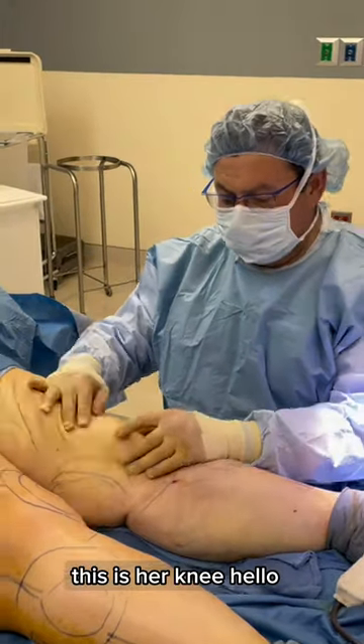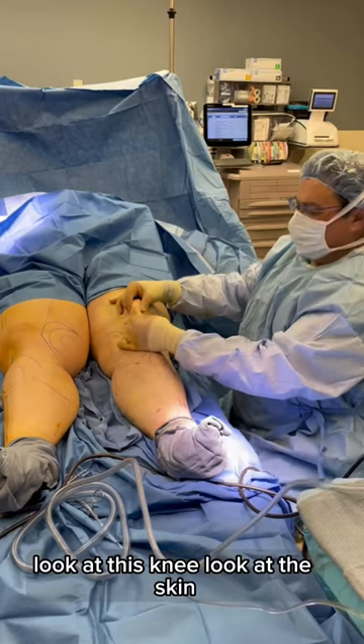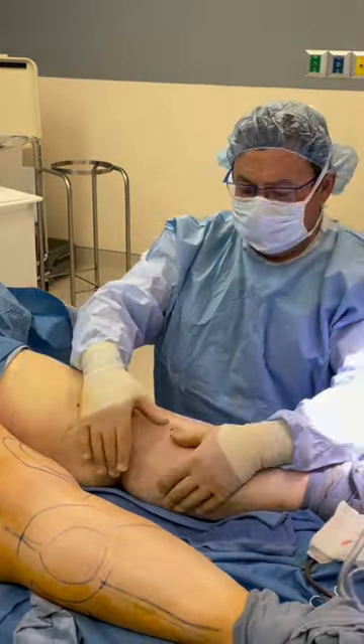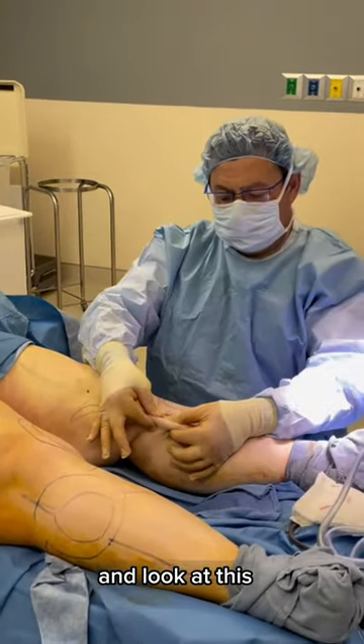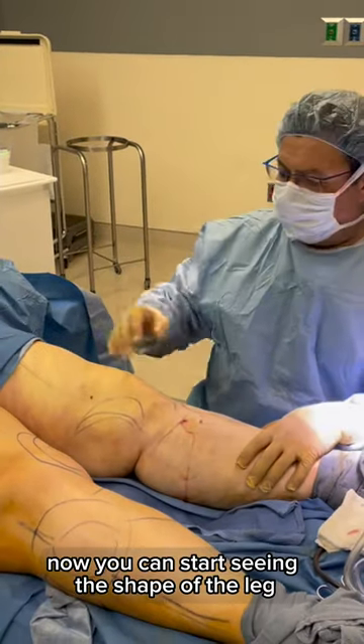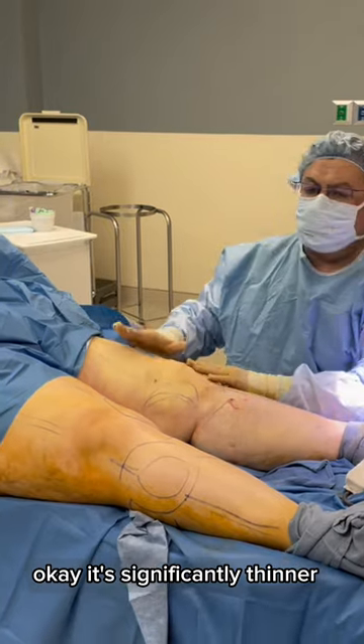If you look at this leg, this is her knee. Look at this knee, look at the skin. Look at this and look at this — look how thin everything is. Now you can start seeing the shape of the leg. It's significantly thinner.